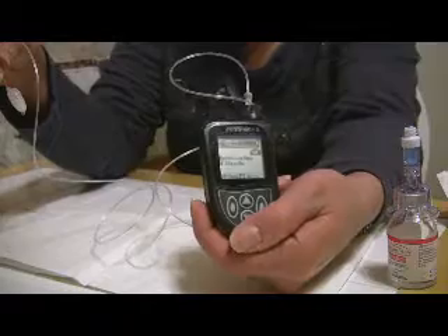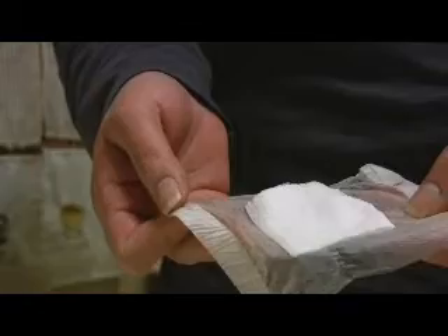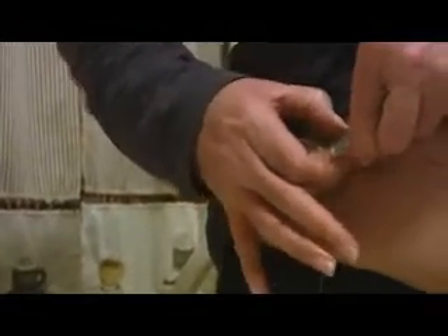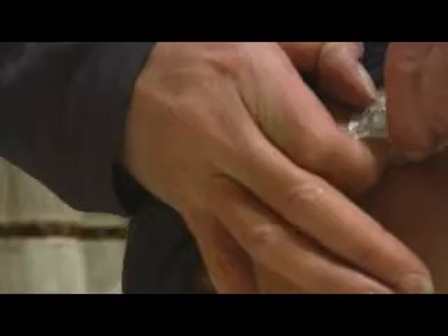This screen shows you that the pump is on. What we need to do now is take off the Tegaderm from the old site so that I can hook up the new site. We're going to pull this off. You'll see that I used a gauze pad so that it does not stick to the actual site and doesn't pull the site up — just a little trick that I've learned along the way.